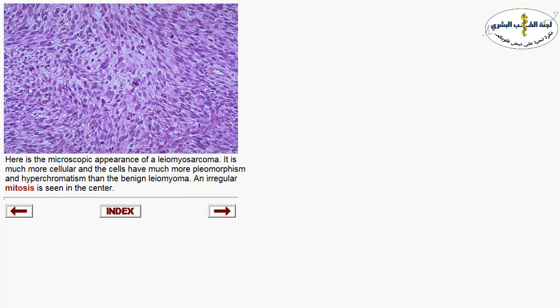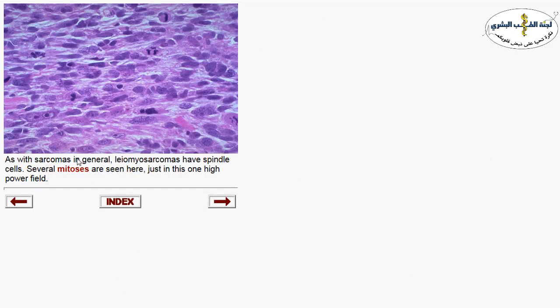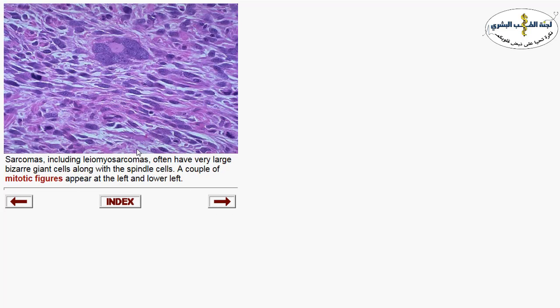Here you see a cellular neoplasm containing many mitotic figures with atypia — this is atypical mitosis. This represents leiomyosarcoma. You can appreciate the atypia with hyperchromatic nuclei. This is atypical mitosis, frequent mitosis, and atypia within the neoplastic cells — all representing a leiomyosarcoma.